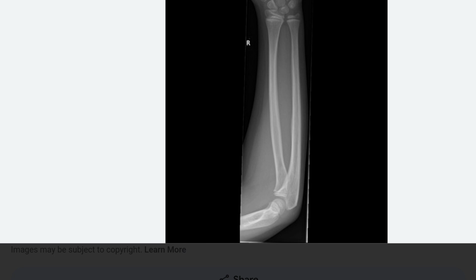What is the importance of this injury? The injury is classified as fracture of necessity and should be managed on emergency basis. Learn also other fractures of necessity and why they are called so. See fracture neck of femur for description elsewhere in the book, and read mechanism of injury and association of fracture from Essential Orthopedic Principle and Practice, Second Edition, in the answer for trauma.